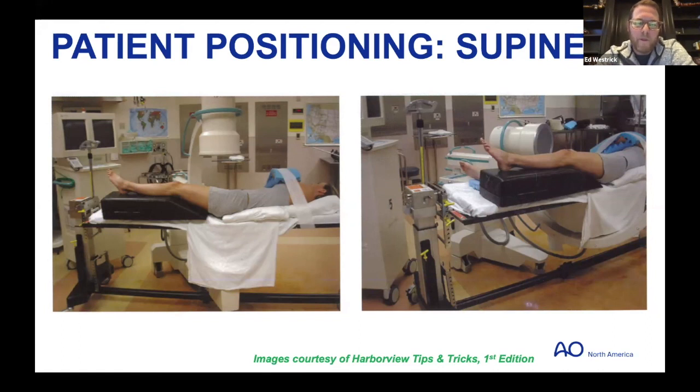But I think the bump placement, having the patient all the way to the edge of the table so that their buttock sags and hangs free and allows unencumbered access. Having the arm appropriately positioned, the bear hugger, whatever anesthesia is using is out of the way. You can see there that ramp is helpful to elevate the extremity. You can apply traction as needed, sterile inline traction.